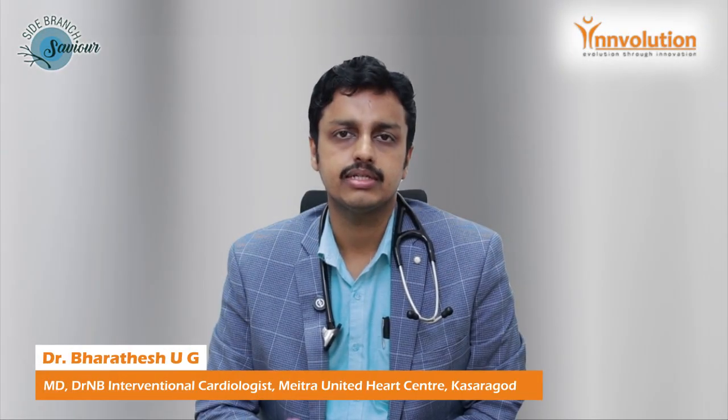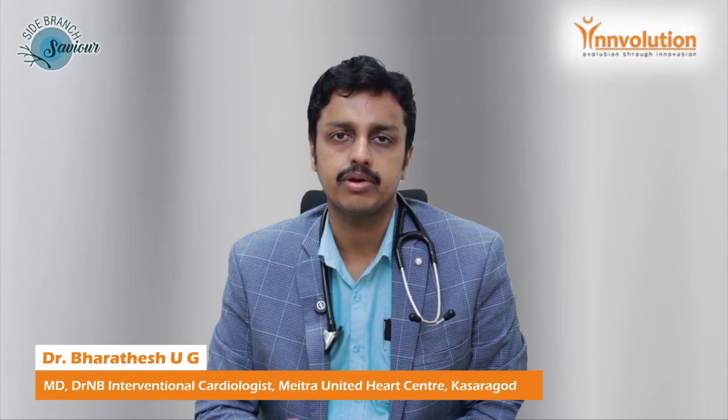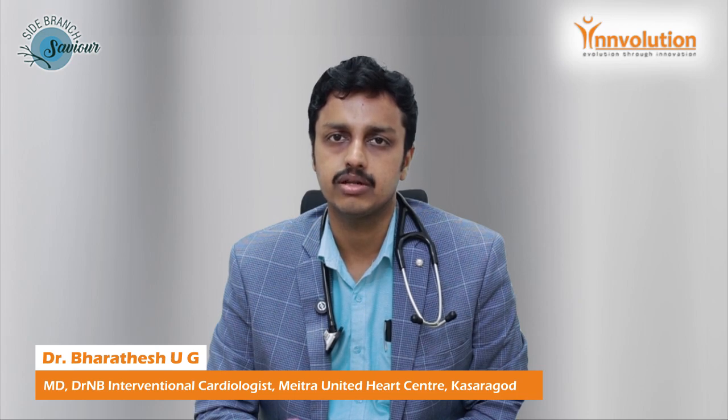I prefer an open cell design with the 6 crown valley-to-valley design, which helps in good side branch access and helps in good tracking of the stent through the side branch. In a closed cell design, it prevents the stent crossing and also the trackability. You may have to push it a lot harder. That may cause stent damage.